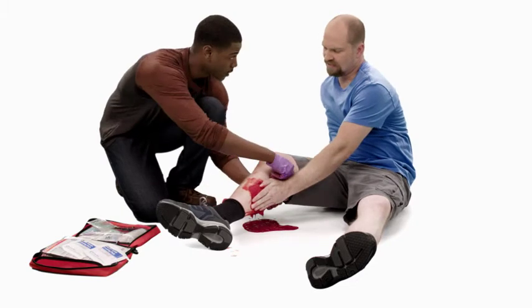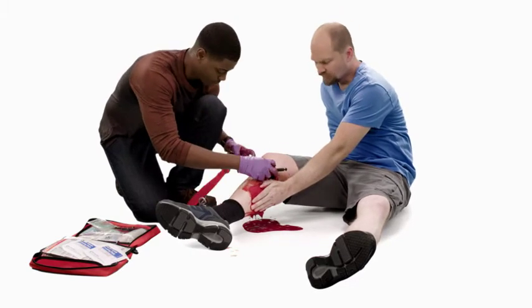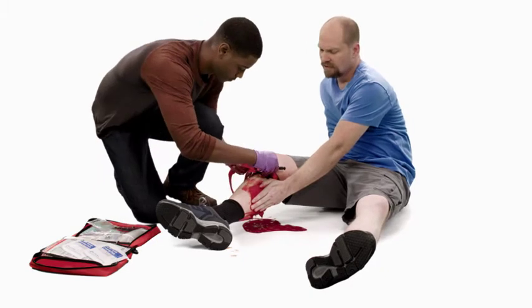To begin, place the tourniquet around the limb, approximately 2 inches above the wound. Avoid placing the tourniquet over a joint.